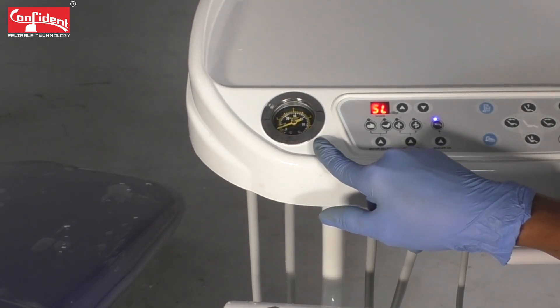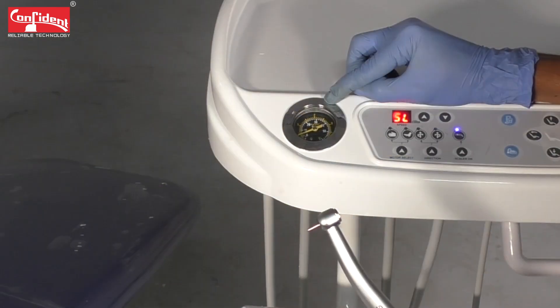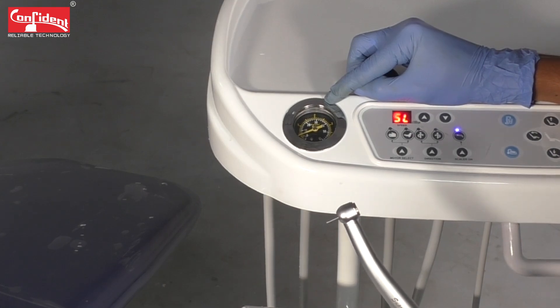When you check the pressure gauge meter, it is showing only 10 psi, whereas we need a minimum of 30 to 40 psi for the air rotor to attain the required RPM to function properly.